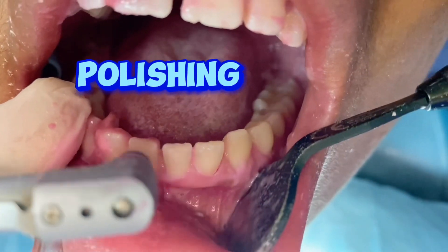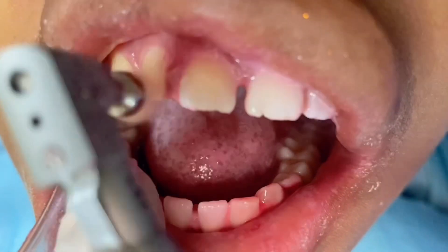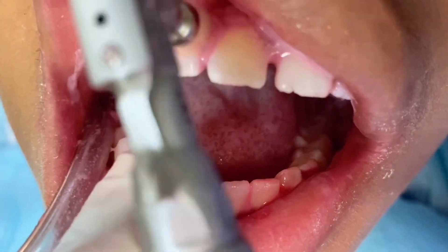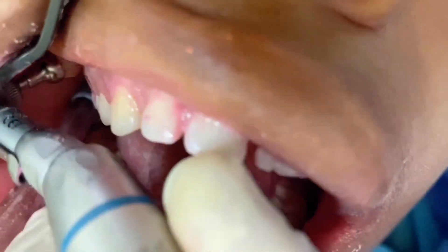At the end, we generally polish all tooth surfaces with prophy paste and brush. We have different flavors — this one is a strawberry flavor, which is actually crunchy.